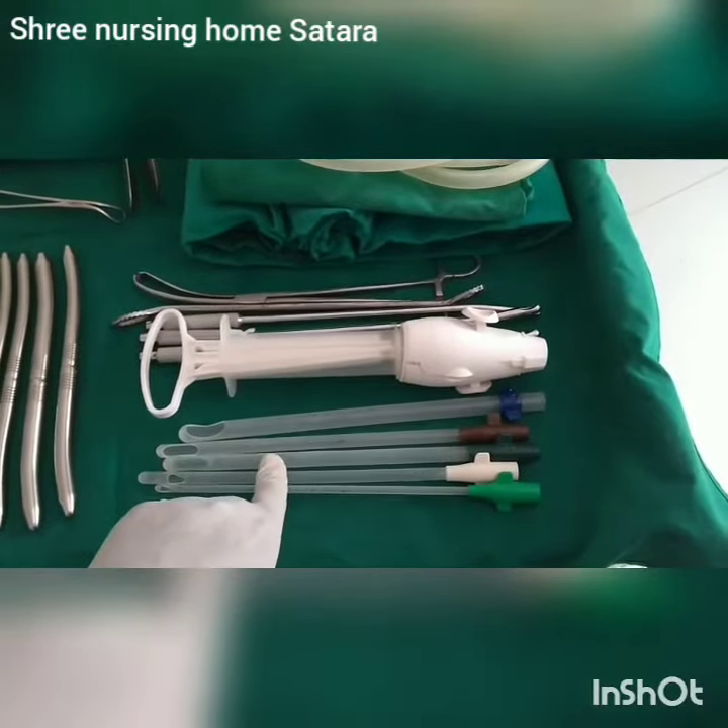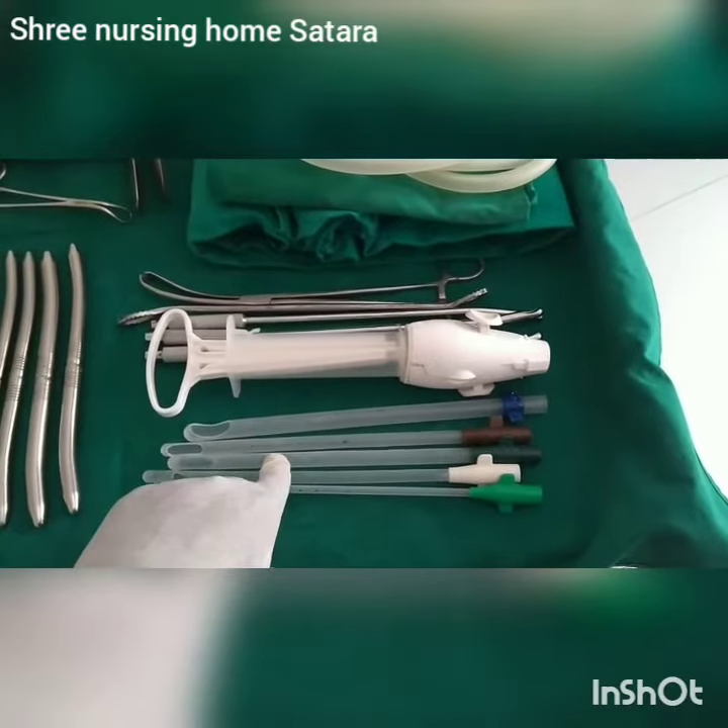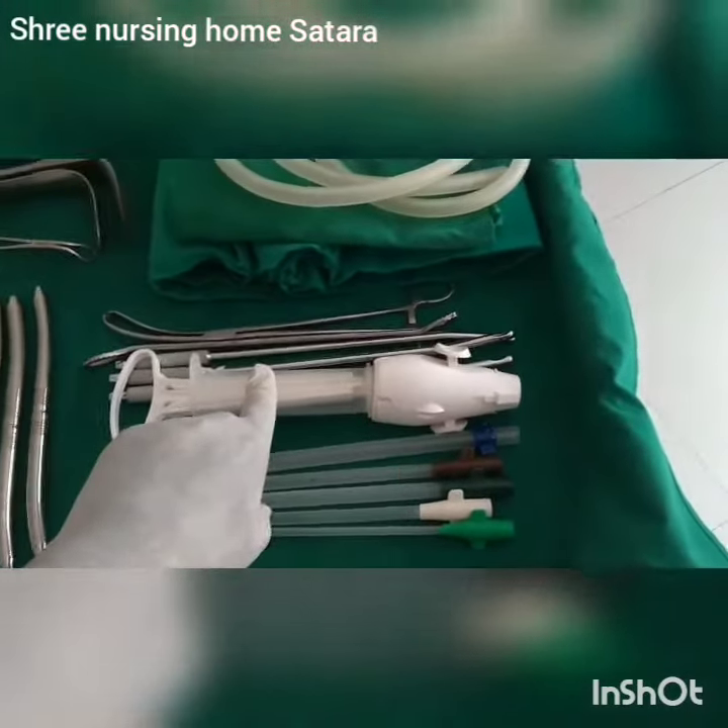These are plastic suction cannulas, which are used for manual vacuum aspiration syringe. This is the MVA syringe. Thank you.